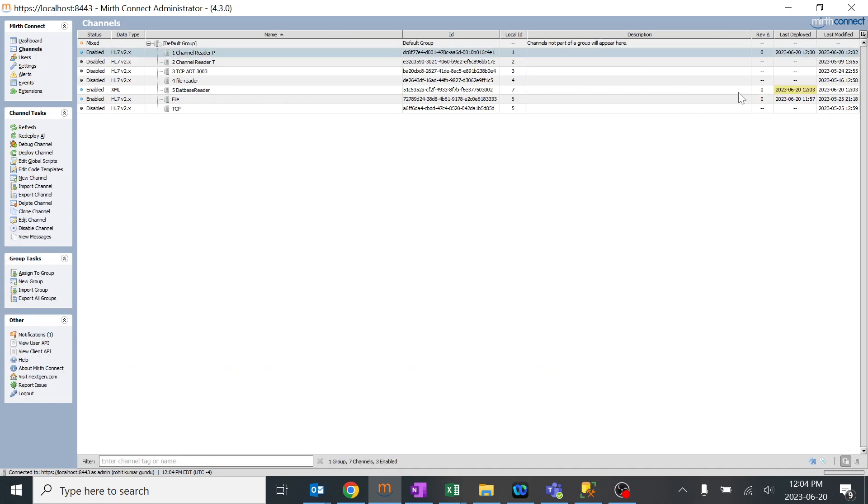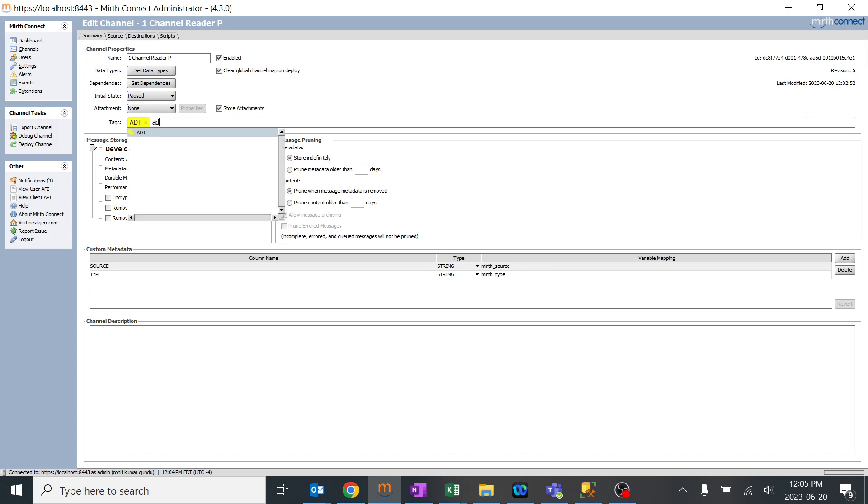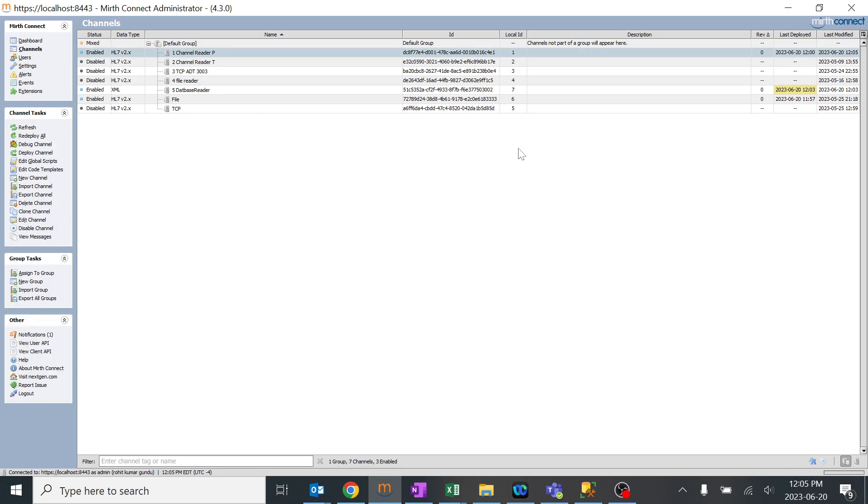What I'll do, I'll take this as a reference of channel. The revision is zero. I'll go and change something over here. I'll add another tag, ADT2, okay. I'll press enter and change, and I'll go back to channels. It should generally mention it.